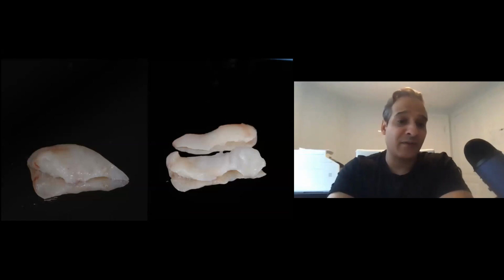Once it's cut out, this is one piece of tuberosity, which I then use the blade to cut into 2 pieces. So you get a lot of graft material out of this one little site. And then usually 2 little interrupted sutures to just close up the wound, and the patient hardly feels anything. So it's a nice place to get tissue without causing any discomfort.